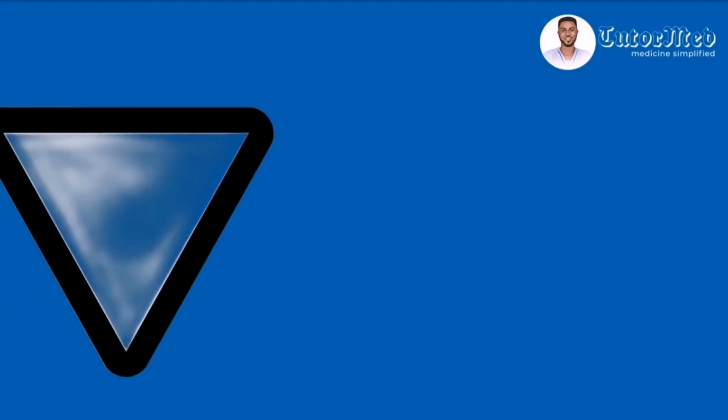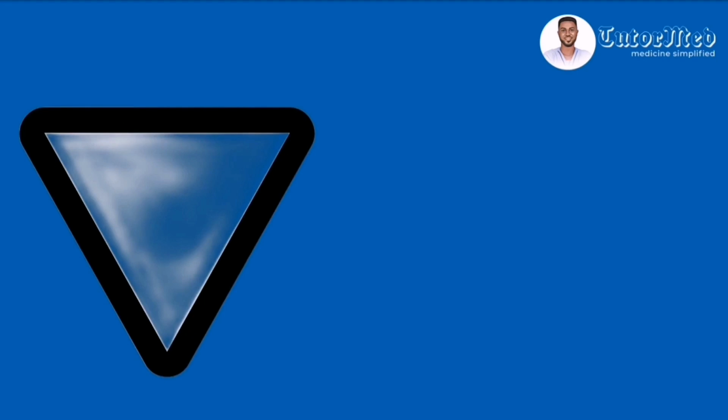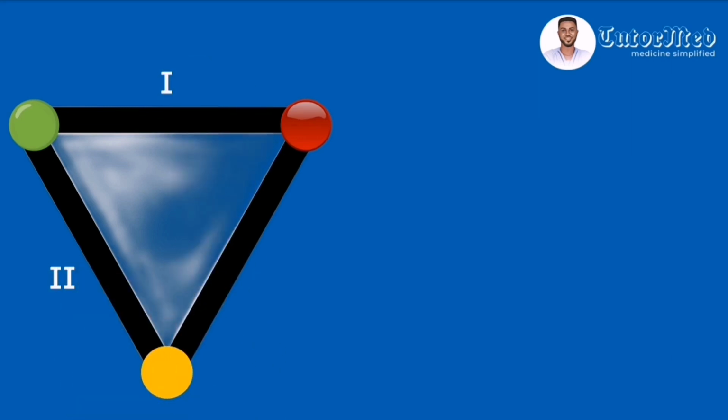Very good. And so on this slide, we want to position all the 6 limb leads around the heart. And we always start with whose triangle? Einthoven's triangle. And so we put our left arm electrode here, the right arm electrode there, and the left leg electrode here. And so we saw that the ECG machine generated lead 1 here, lead 2 there, and lead 3 here.